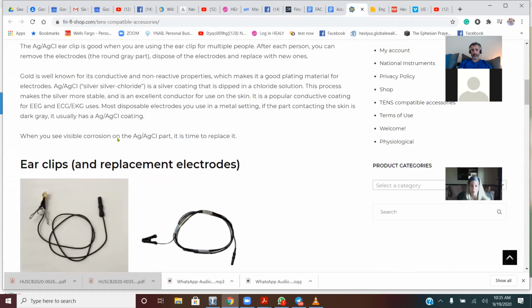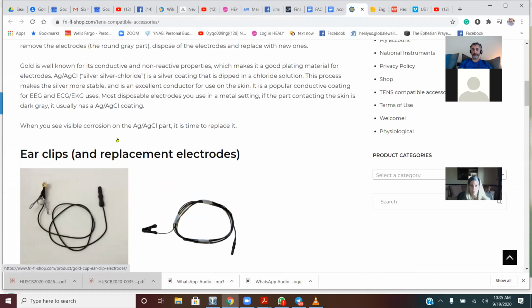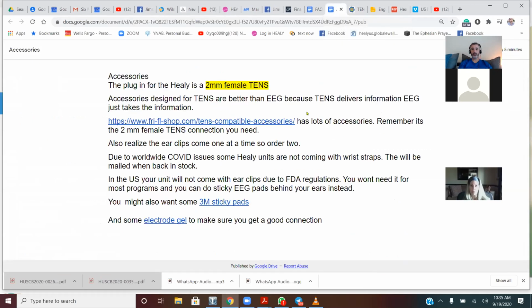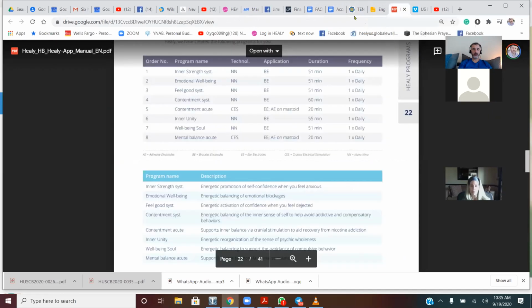But this is a place where you can get different TENS compatible accessories. If you'll notice on the accessory page, it says you need a 2mm female TENS connection. Anyways, going back to the device itself.